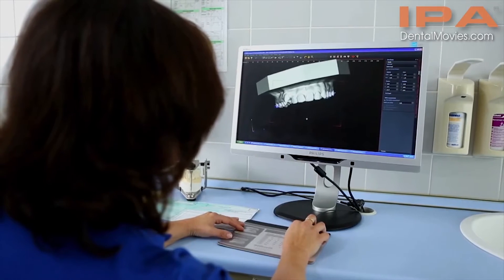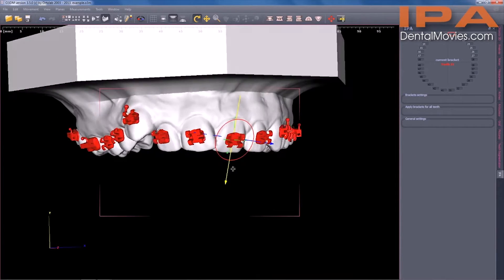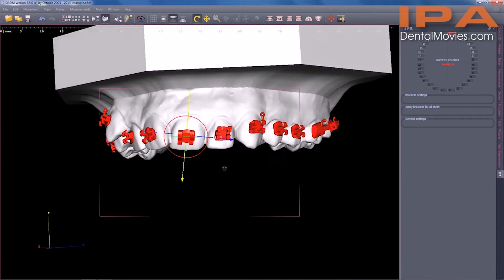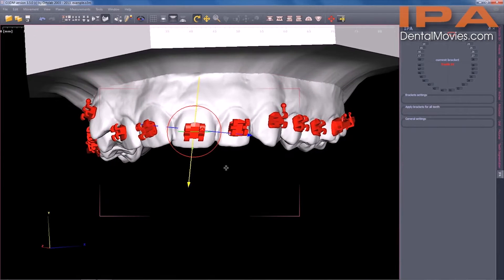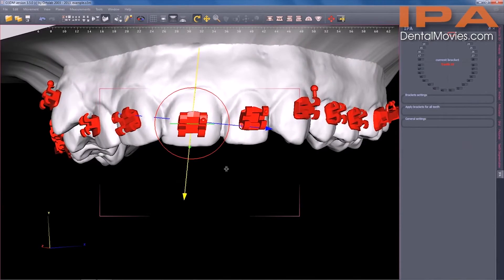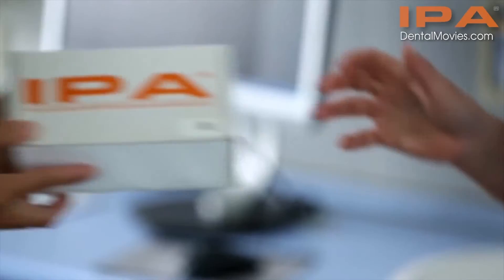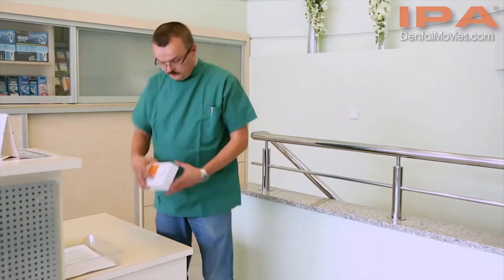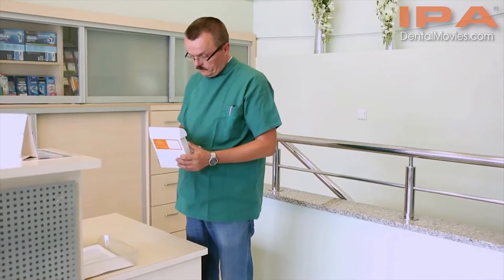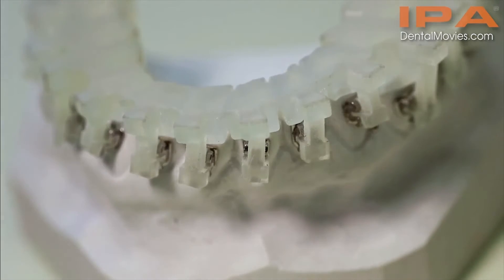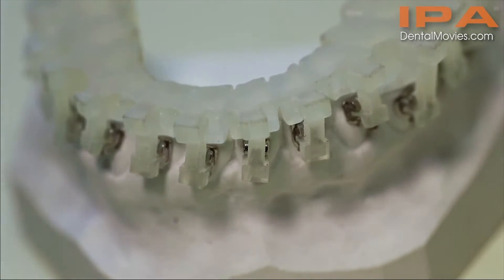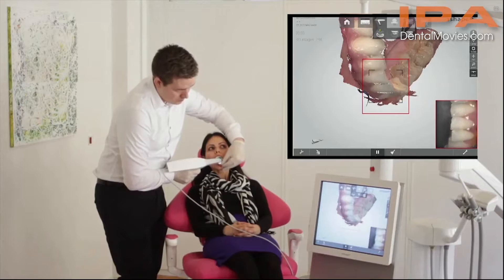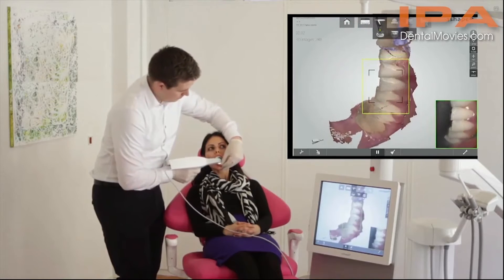The O3DM software is designed for working with digital models and it includes tools that ensure efficient treatment planning as well as support the course of treatment. The IPA system does not change the standard working procedures of the practitioner nor affect cooperation with the orthodontic laboratory. The IPA system is compatible with the new intraoral scanners which additionally simplify both the diagnostic process and treatment planning.